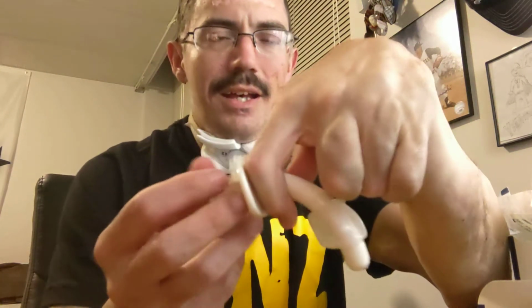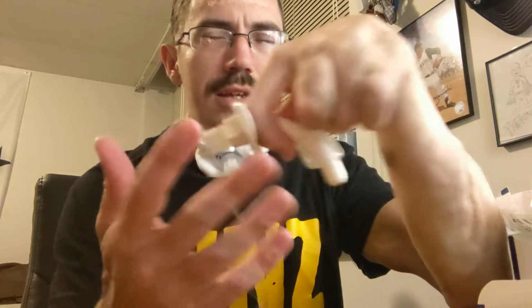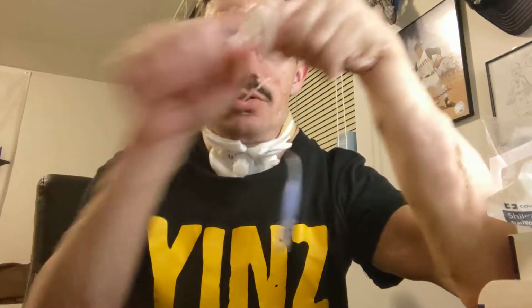When you need to sleep with the oxygen on, they take the oxygen hose and put it right up against it. That's when you inflate the balloon, because otherwise oxygen can escape out of the mouth and out of the nose, and you're not getting all that direct oxygen. So they inflate the balloon, and all the oxygen goes directly into your lungs.